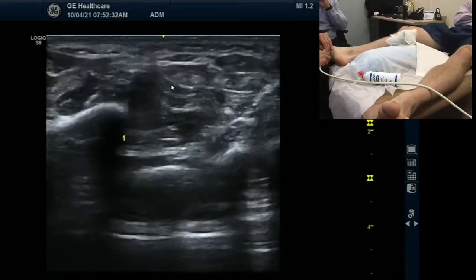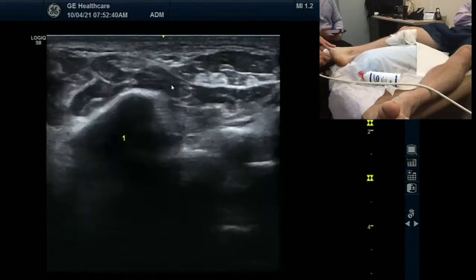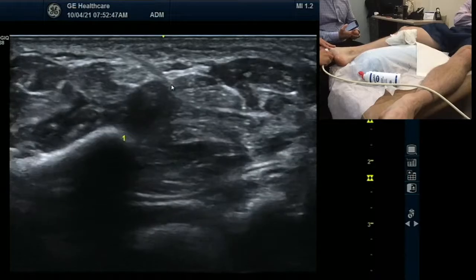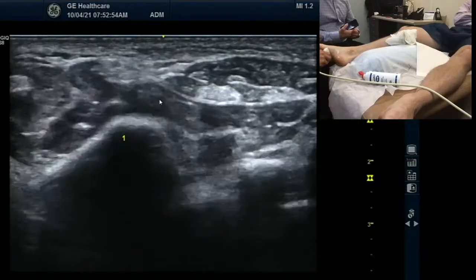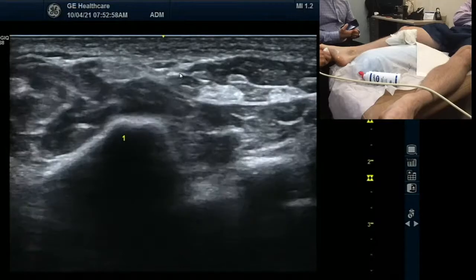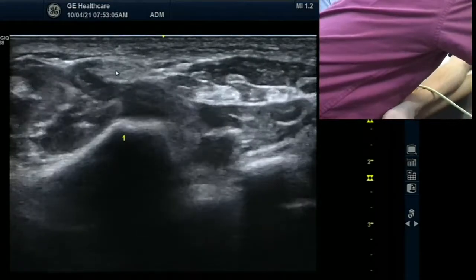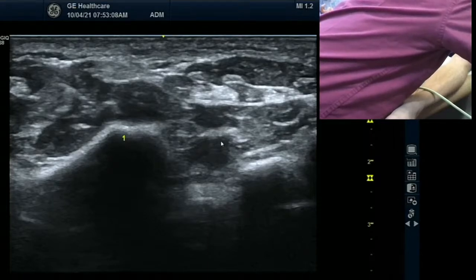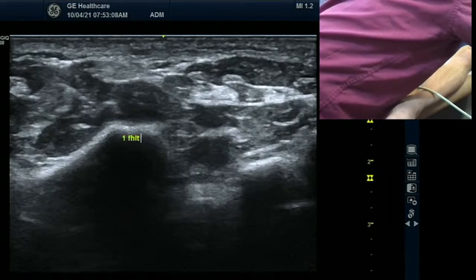So now I'm at the medial foot. This is abductor hallucis. The top one. And then there's a flexor hallucis brevis and a flexor hallucis longus — that's what I wanted to scan. But longus is tendon already — it's a tendon here already. So can we decrease depth? I must be in the middle one. Can you move his big toe? The tendon — see? That's the tendon. That's flexor hallucis longus. Yeah, so that's flexor hallucis longus. Freeze. This one is the flexor hallucis longus tendon. FHLT.